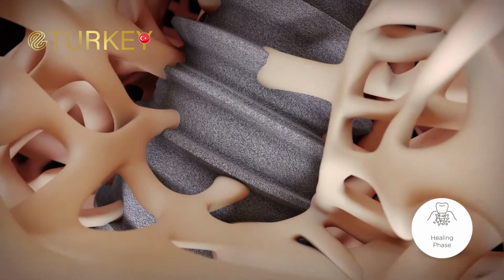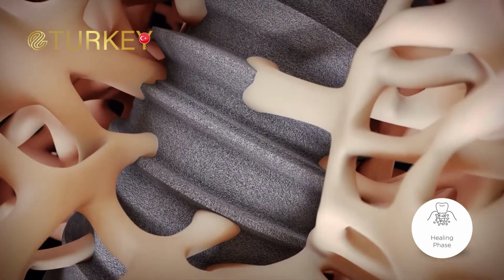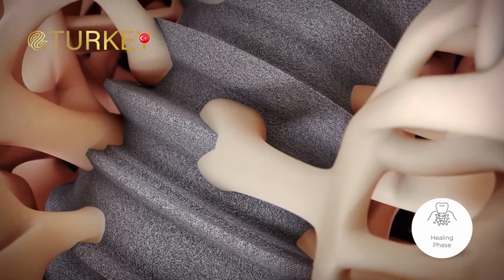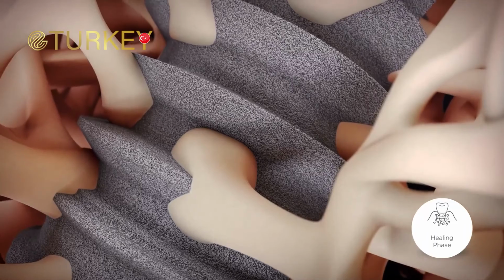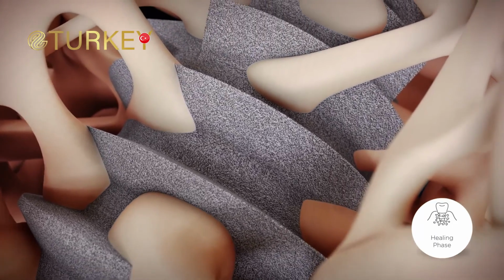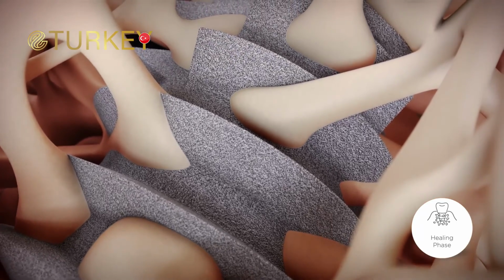During the healing phase, the implant is completely integrated with the bone tissue. Innovative technology and a growth-activating surface provide for secure and quick healing. Ask your dentist about your personal healing time.